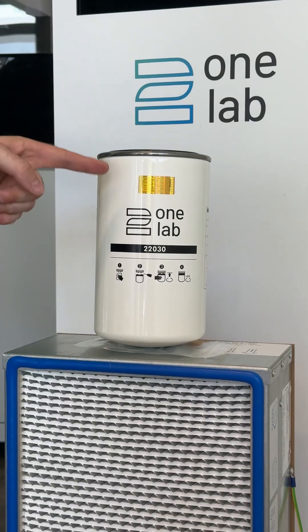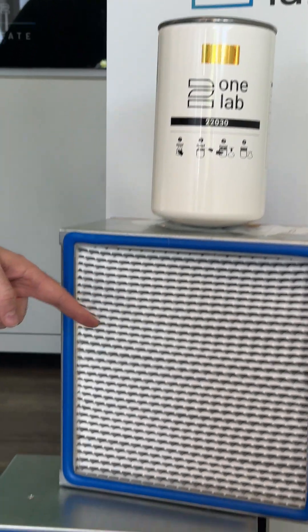Next step, you change the filter. You change the exhaust filter, the pre-filter, and the main filter from the system.